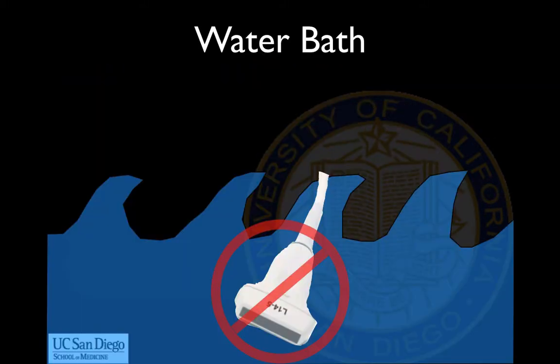While the probe footprint can be brought under the water's surface, please ensure to avoid bringing the proximal portion of the probe or wires into the water.